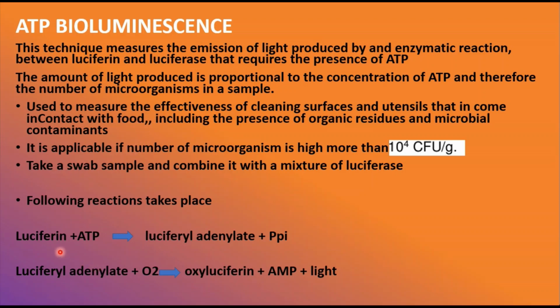If you see the reaction here, luciferin utilizes ATP and gives rise to a compound called luciferyl adenylate, which requires ATP. That means it is going to break the ATP, and this compound reacts with oxygen. As the organisms take up oxygen, luciferyl adenylate in the presence of oxygen gives rise to an oxyluciferin compound as well as the emission of light, which we find with the luminometer.